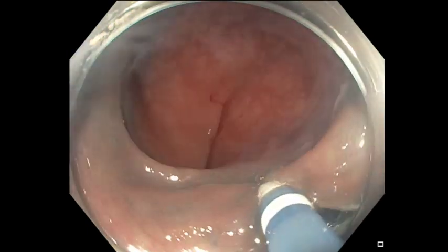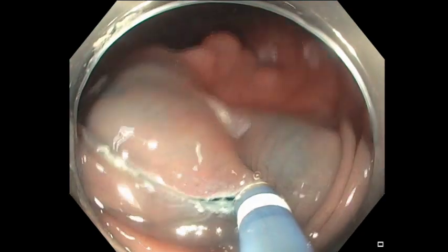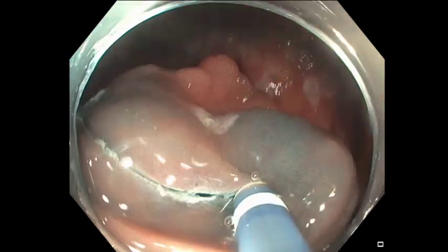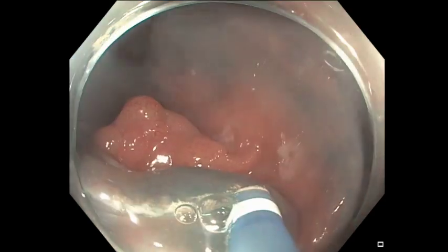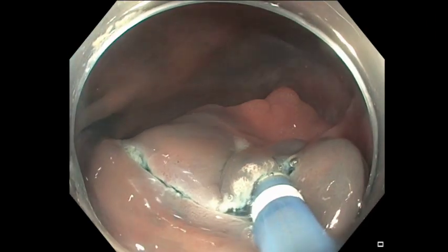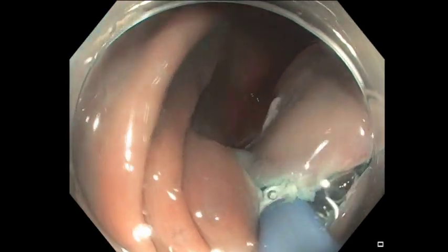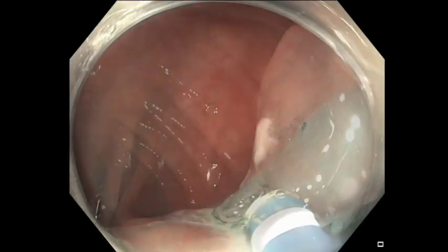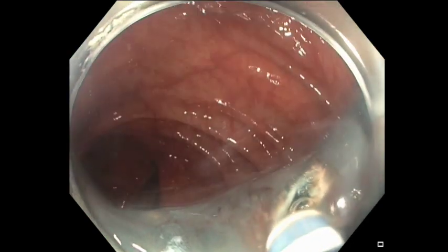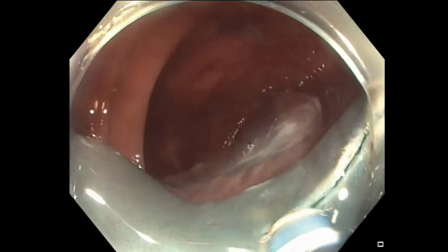I don't do tunneling in most of the cases, and what I would like to show here is the gravity-assisted technique, which is an alternative to traction. If you want to do standard ESD, which is a circumferential incision around the lesion, you will have to do one of two things: either allow gravity to help you to retract the lesion, or use a traction device. In this video, I'll highlight how you can use gravity in your favor.